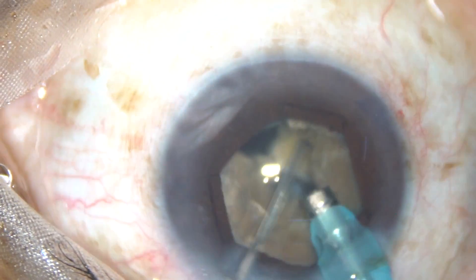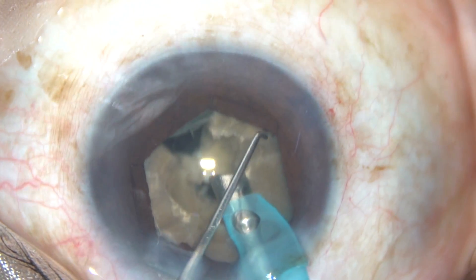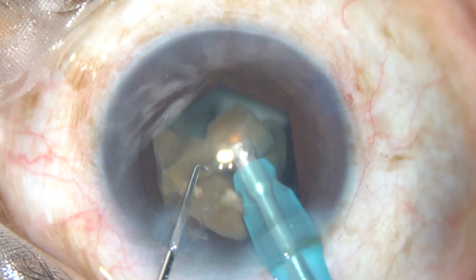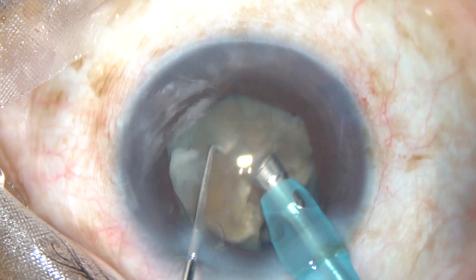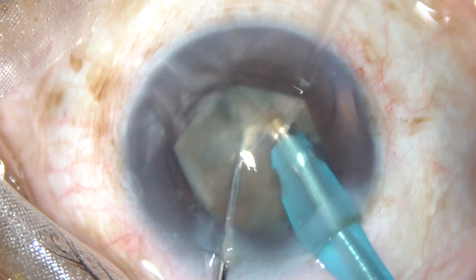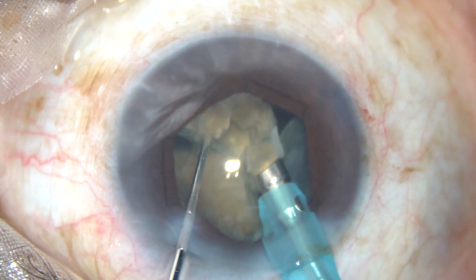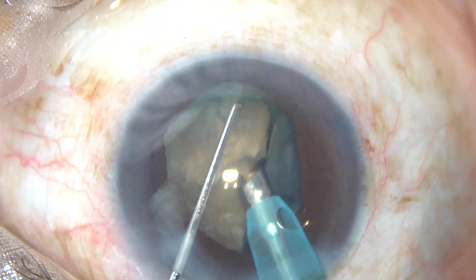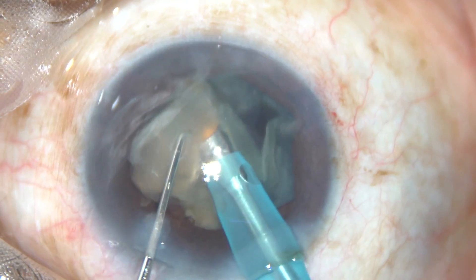I emulsify the pieces. FACO1 mode is low vacuum, low flow rate, high power — in this case 80% power, flow rate 25 ml/min, vacuum 70 mmHg. In FACO2 mode, the power is 75%, flow rate is 40 ml per minute, vacuum is 400 mmHg. The leathery band joining the two fragments can be cut with ultrasonic power, and we can then emulsify the portion in front of the tip.